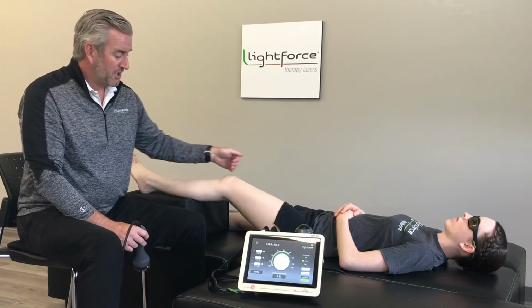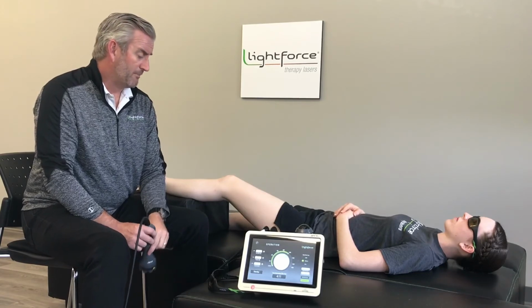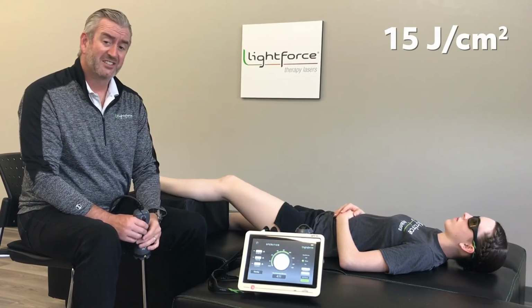But if you really wanted to try to increase some analgesic effects, you could come proximally on the leg and treat the femoral nerve in the area of the inguinal ligament, right before it branches out into those different branches in the femur, into the quad. So you could treat that area at a much higher dose, somewhere in the ballpark of 15 joules per centimeter squared, and using your higher power that you have available to maximize that nerve response, reducing conduction velocity and reducing the compound action potential that's coming back from that afferent. And the result might be that the pain from the person's knee comes way down.